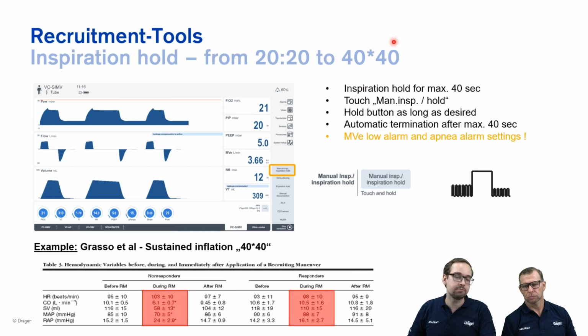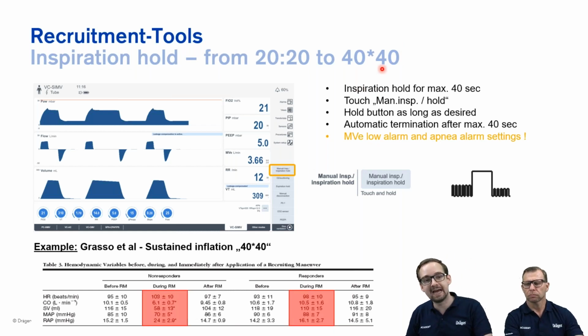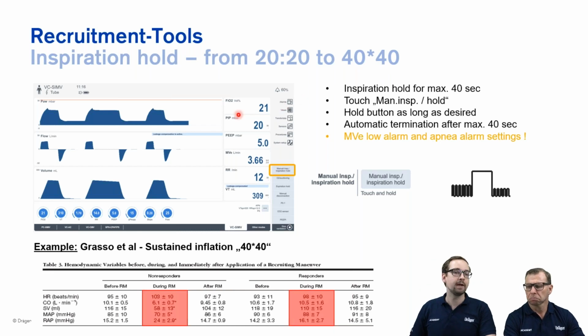Why are we looking at these longer timelines? Of course, we know that lung recruitment takes time. Lung recruitment is always a result of mean airway pressure and time. So this is why the timing of the inspiration hold is actually very important.